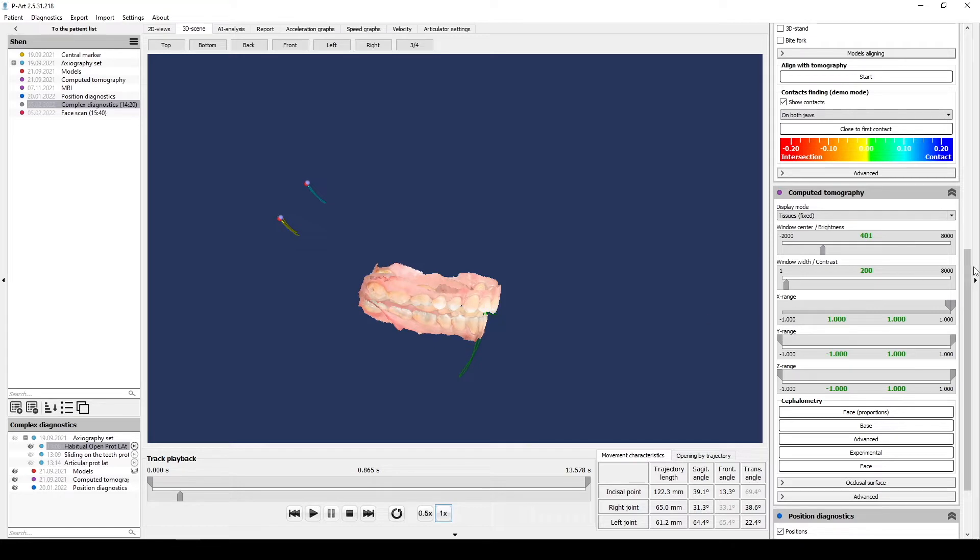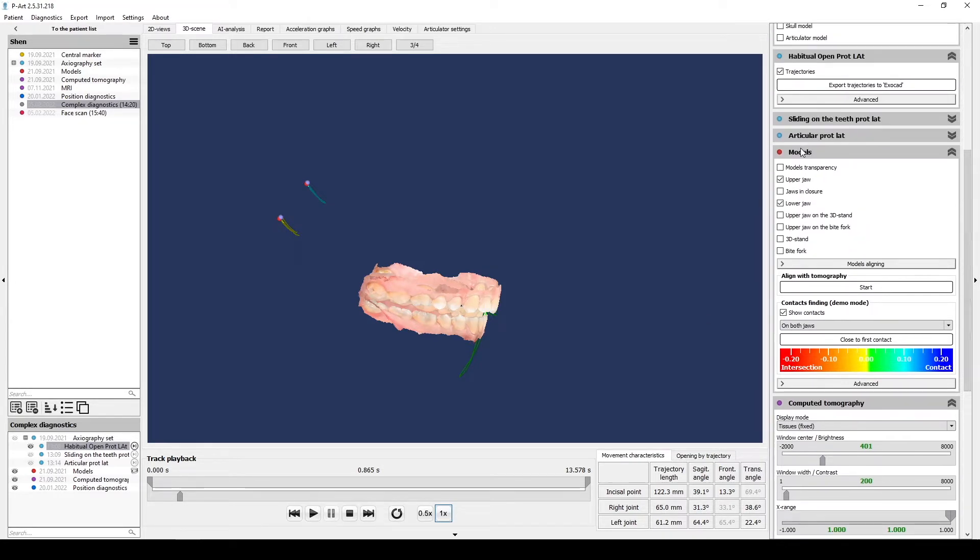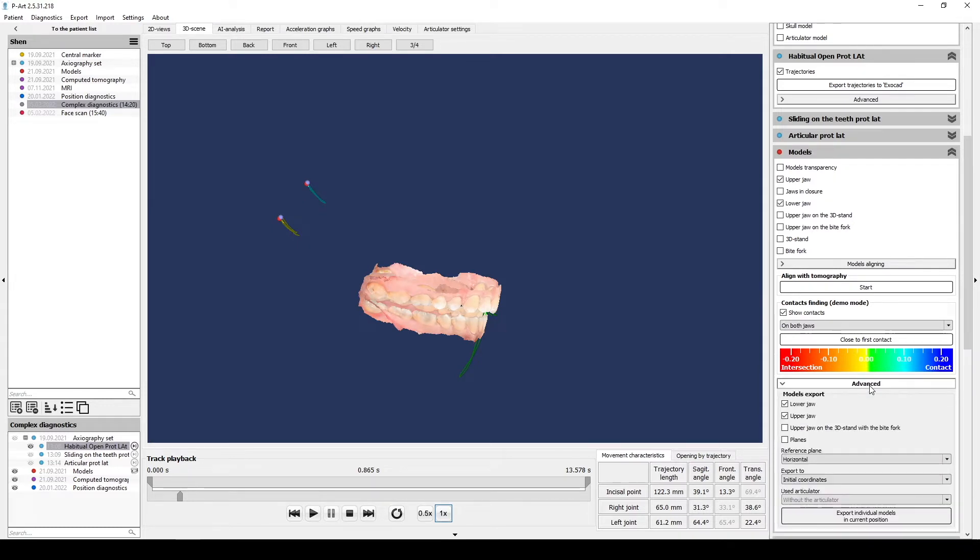For that you need to select section individual models in the right menu, find subsection Advanced, and tick lower and upper jaws.